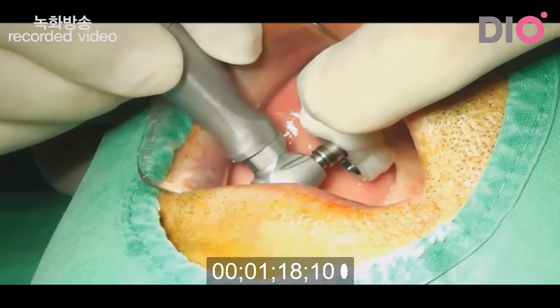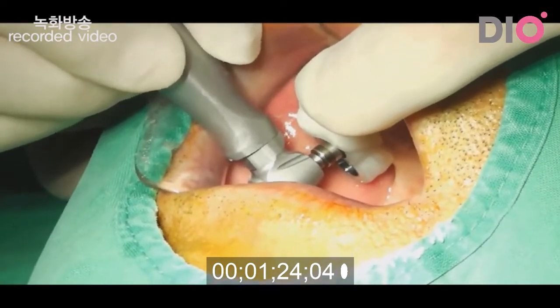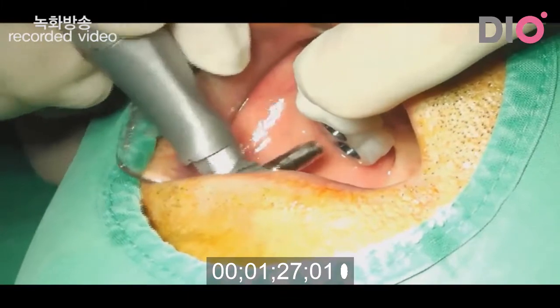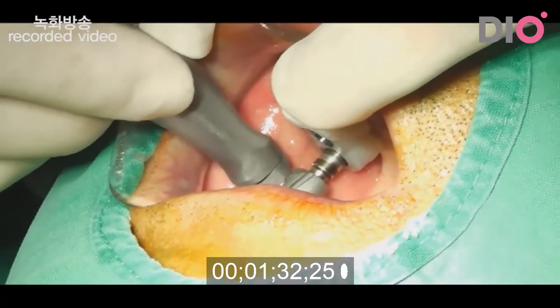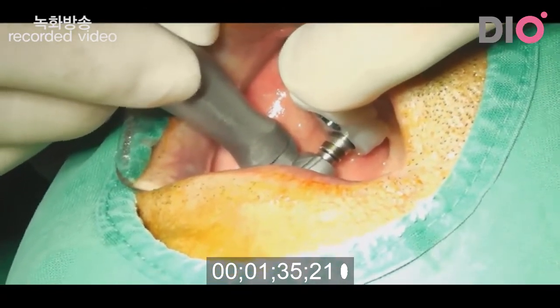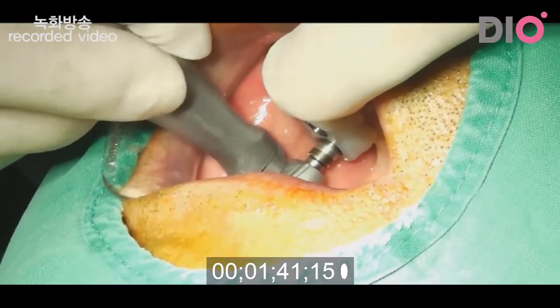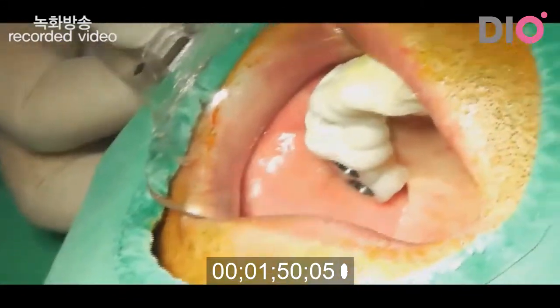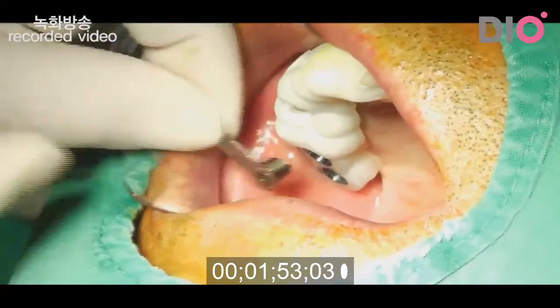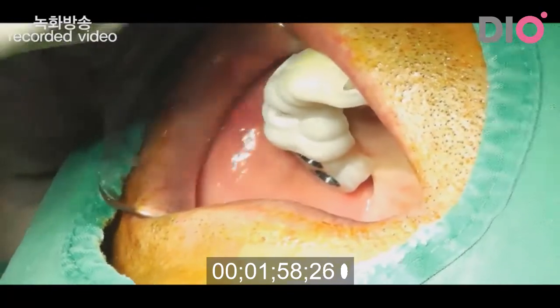I will drill through the surgical guide to flatten the ridge, and then in the second molar area as well. And then I finish flattening the ridge. And then this is the guide tube. I will place this one into the surgical guide.